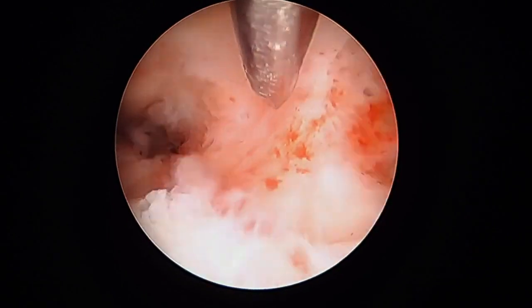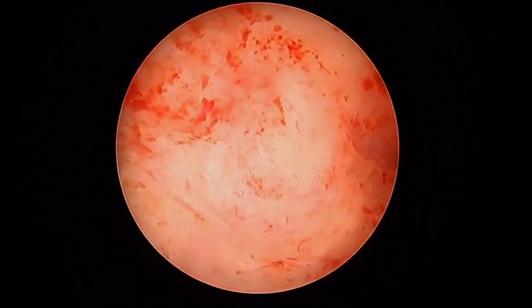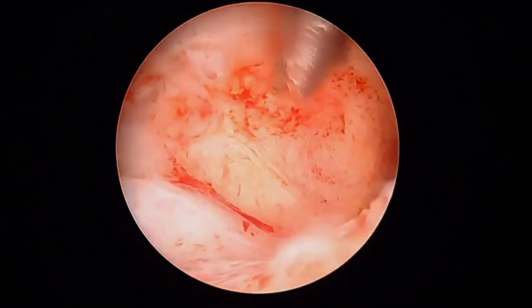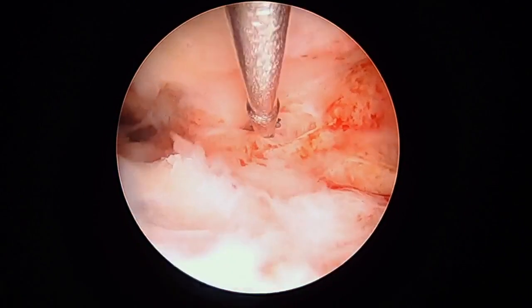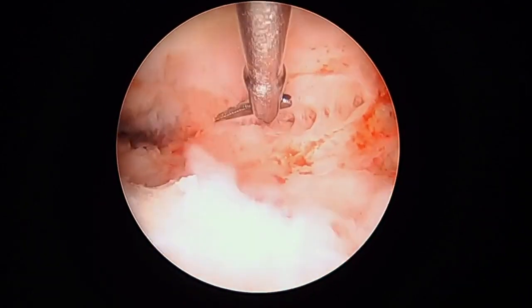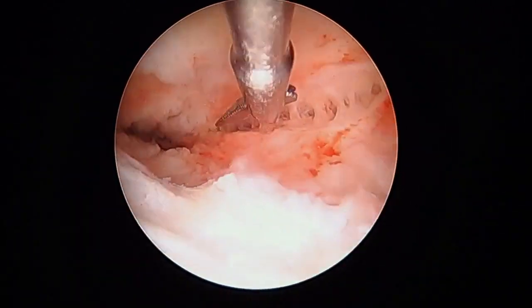As the hysteroscope is guided across the fundus to the left side, the tubal ostium is noted. However, scar tissue is noted in the midline.